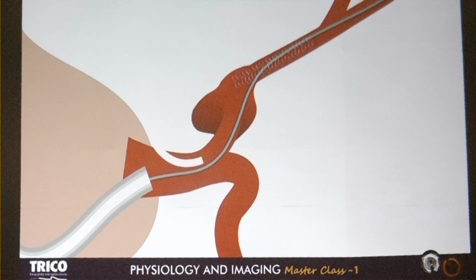This is not a perfect cartoon. We are going to work on this. This is the dissection, a spontaneous dissection, and here the hematoma is catching up. It's actually a life-threatening problem. It would have extended, and the patient would have suddenly died.